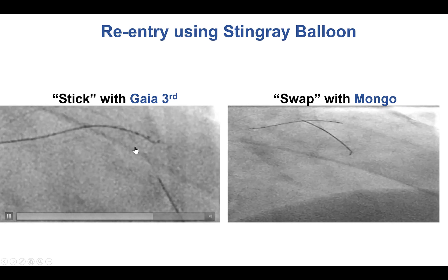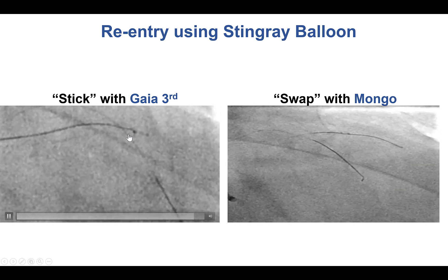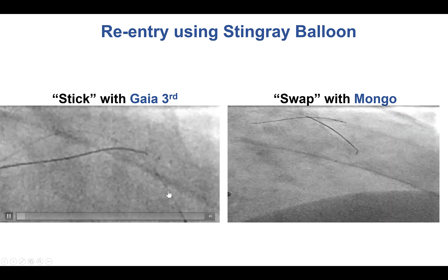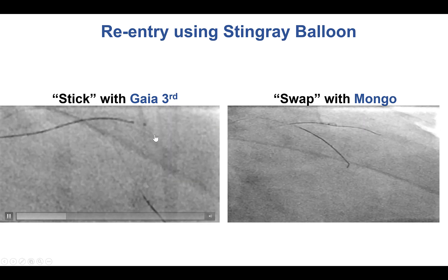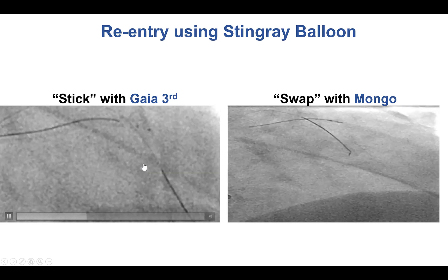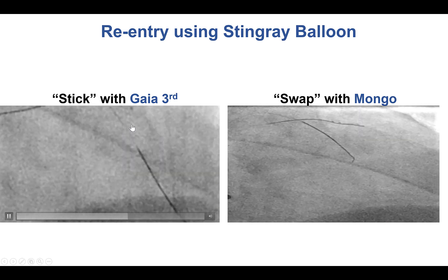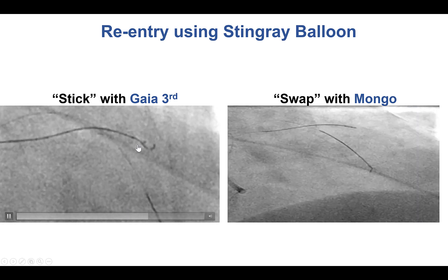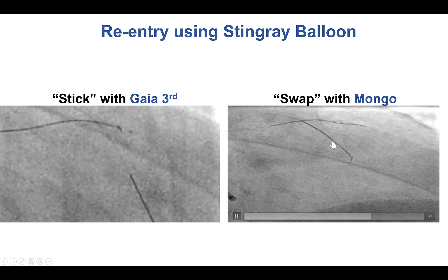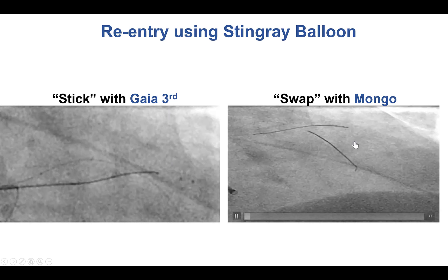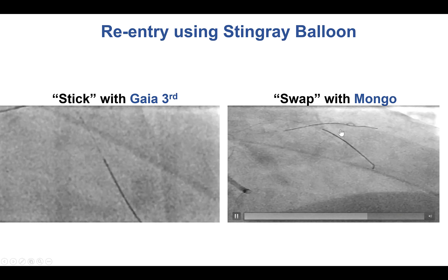Therefore, re-entry was essentially blind. We performed the so-called double-blind stick and swap, sticking from both sides. The exit port proximal to the proximal marker was used, but we also advanced a Gaia third wire into the exit port between the two markers — sticking both inferiorly between the two markers and superiorly via the exit port proximal to the proximal marker. We then used a polymer-jacketed Mongo guide wire, which exits from the proximal exit port and seemed to advance smoothly along the course of the vessel.